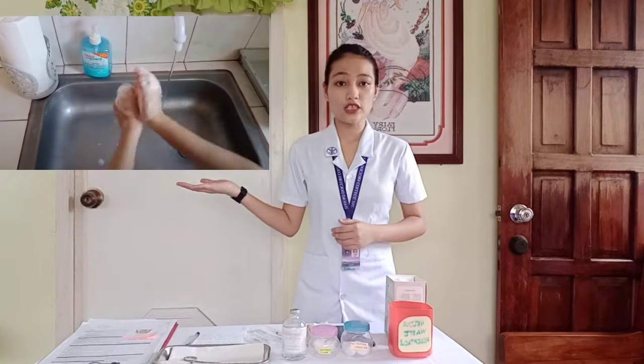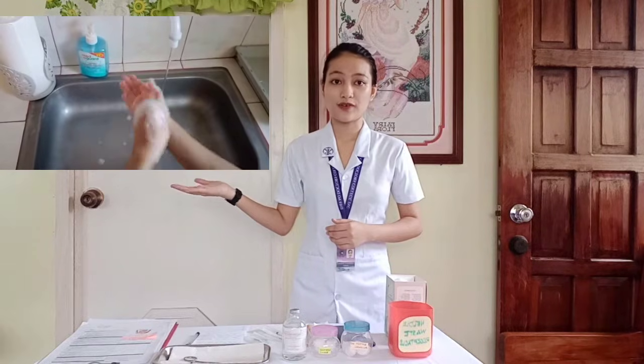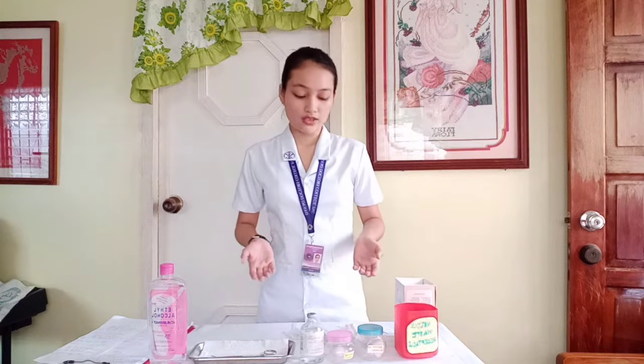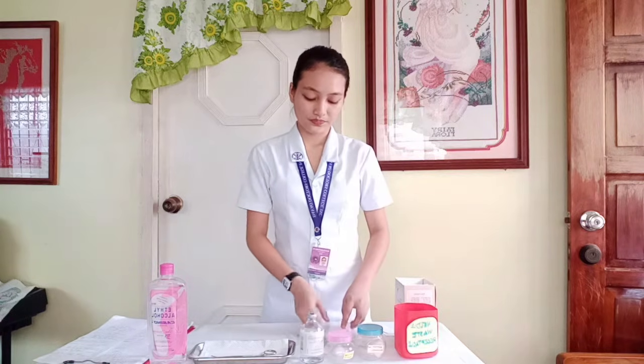After that, perform hand hygiene to deter the spread of microorganisms and avoid cross-contamination. To prepare the medications, of course, we need to have syringes. I have a tuberculin syringe, which is ideal for skin tests or intradermal injections. I also have an insulin syringe for subcutaneous injection and a 23 gauge syringe for intramuscular injections.